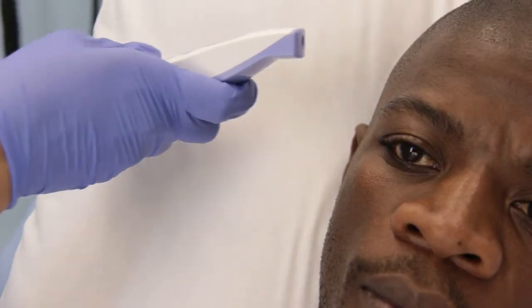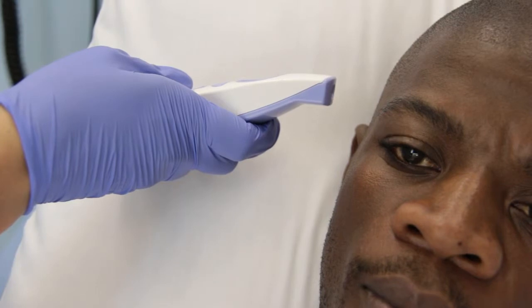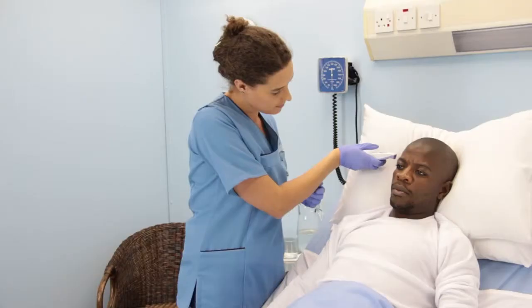With your dominant hand, place the thermometer over the selected skin surface, approximately 2 cm away from the skin surface. Press the start button. Keep the thermometer steady in one place and wait for the indication that the reading is complete.